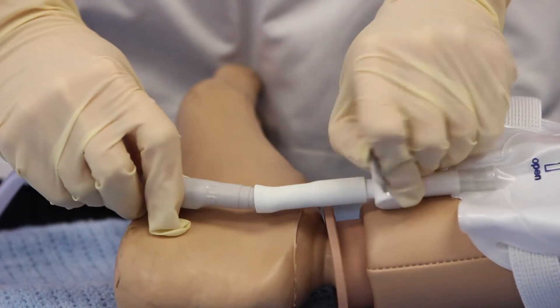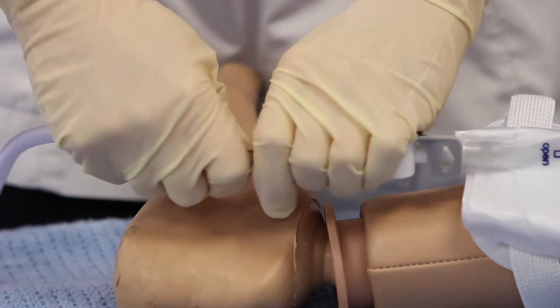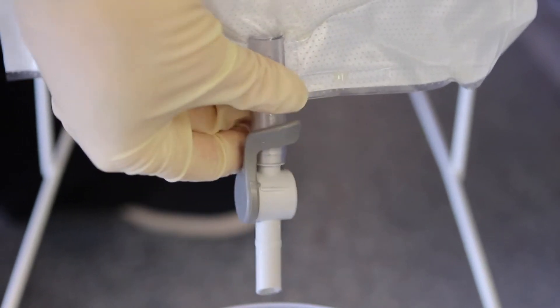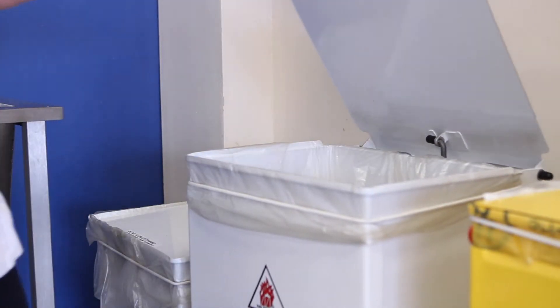To disconnect the night bag, position the tap upwards and disconnect the night bag, then drain and discard. Night bags are single use only.